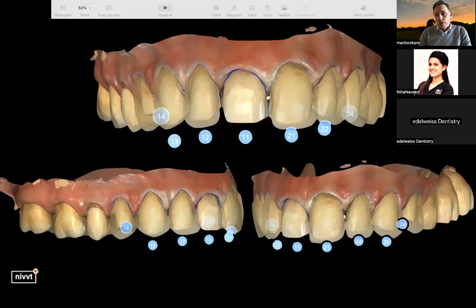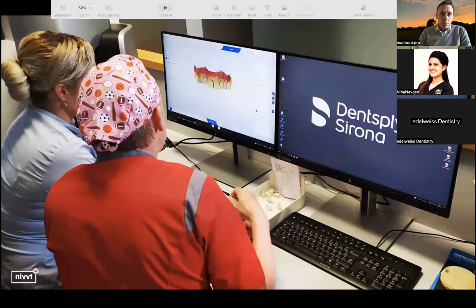We decided here to go for 2 full crown preps on the premolars, 1.4 and 2.4. The reason is that we wanted to have a stop, because palatally she doesn't have enough of her own teeth anymore, and we want to get a stop so that we are sure that she doesn't break the restorations. And for the rest, we go for minimal invasive veneers, like you will see immediately.